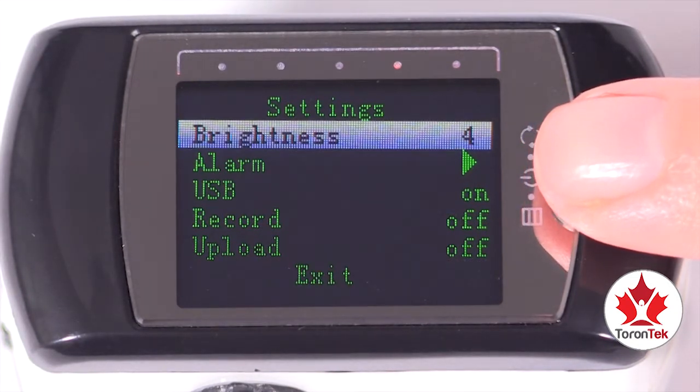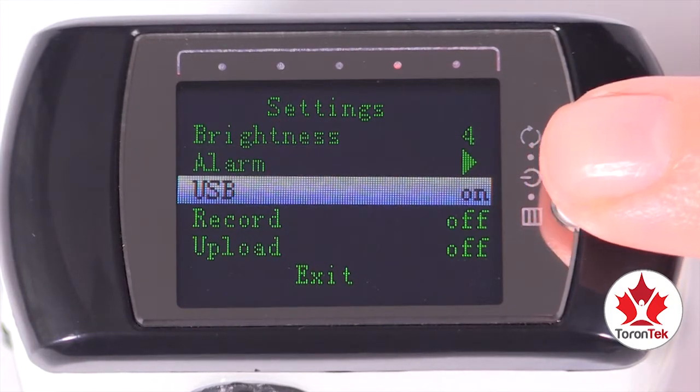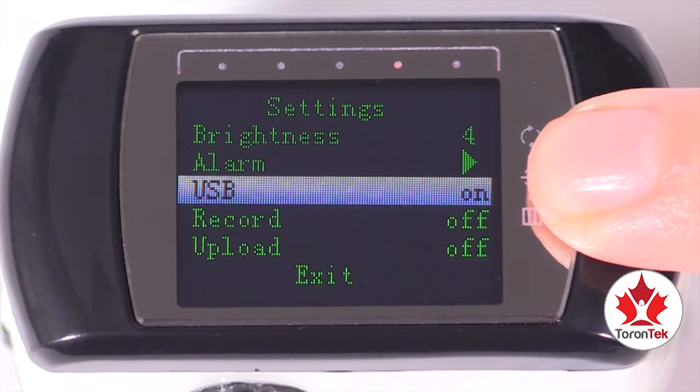To select one of the settings, highlight it and press the menu button for two seconds. Sometimes that will change the option on the same screen, for example, on or off.